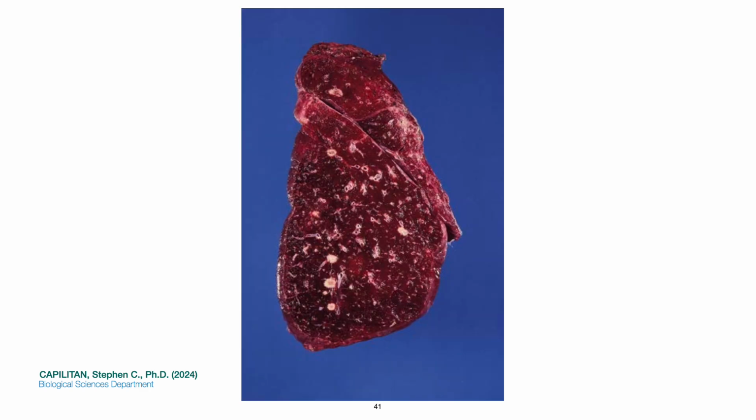We have also pulmonary metastasis. Multiple well-circumscribed nodules are seen in this section of your lung, in keeping with metastatic tumor deposits. And that's dysplasia and neoplasia.